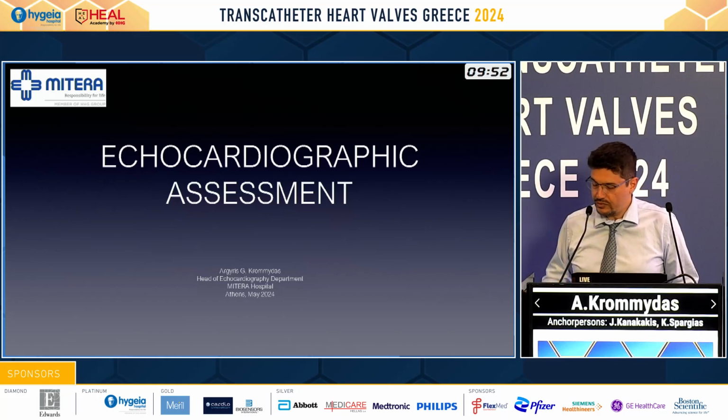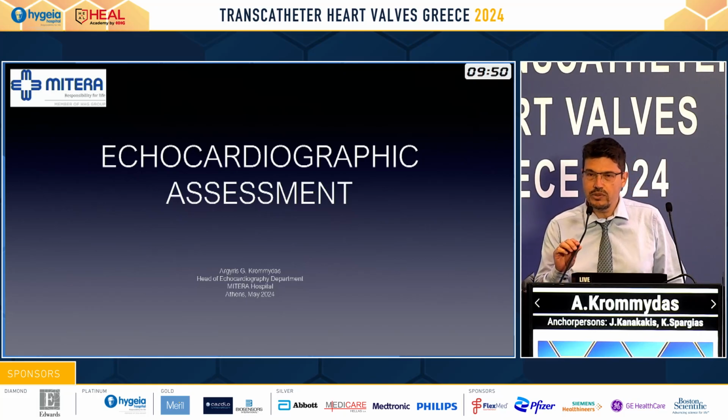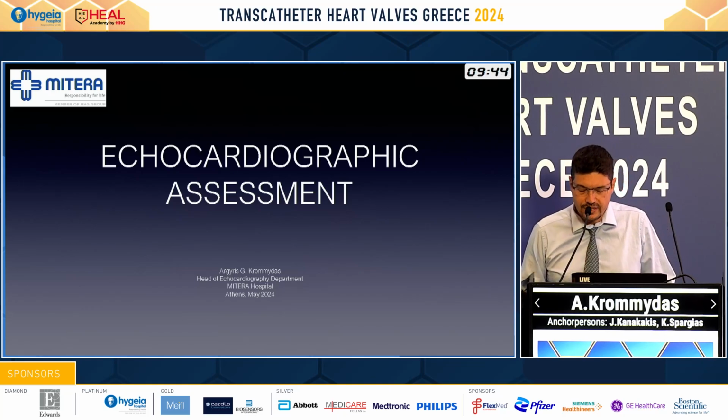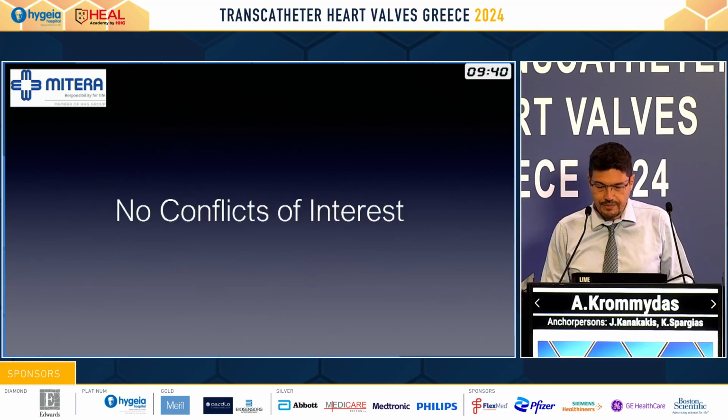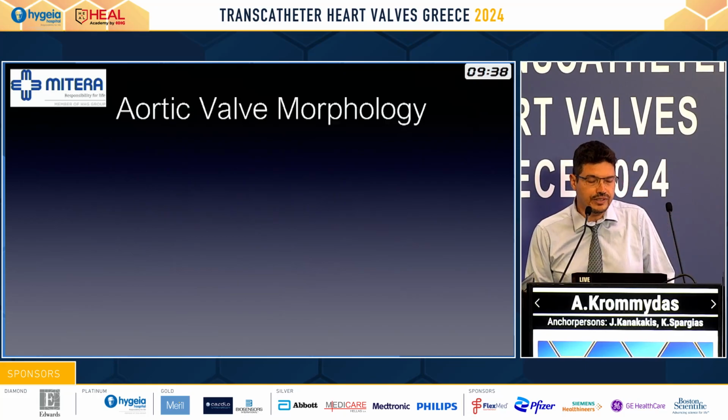We had a very interesting session about the durability of the valves. It's very important to assess correctly the severity of the aortic stenosis. So our topic today is about echocardiographic assessment on TAVI procedures. There is no conflict of interest.